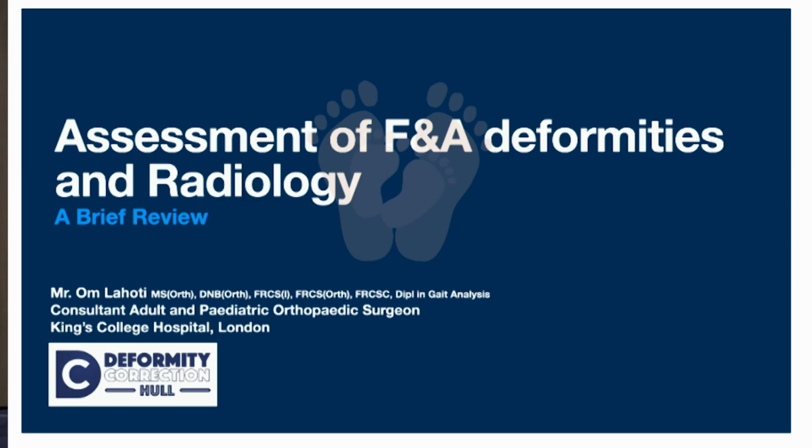How do you do an intraoperative Saltzman view? That's what I'm saying. It's a calcaneal axial view. You can't do all that. So you should plan how much displacement you need beforehand by doing those calculations, how much calcaneal displacement you need. So you can only get an axial view of the calcaneum. You can't get Saltzman's view there. So you should have all the planning, and you say, I'll lateralize it or medialize it by certain millimeters.